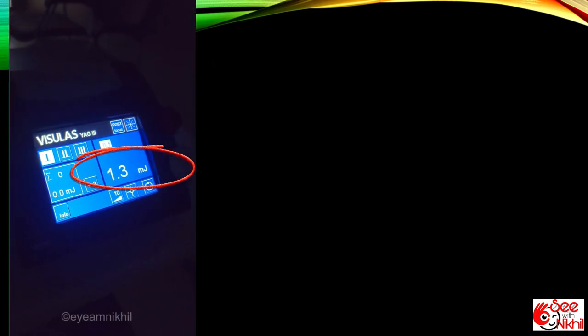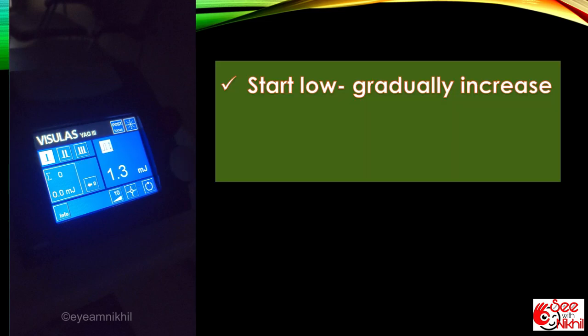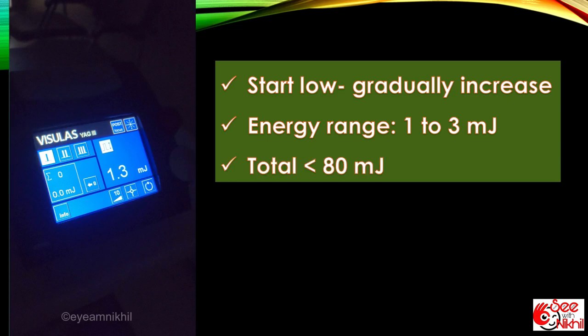Energy is kept at around 1 millijoule. Start with low energy and gradually increase if necessary. The idea is to use the lowest amount of energy required to create an opening. Usual range is from 1 to 3 millijoule depending upon thickness of PCO. We try to keep the total energy applied to less than 80 millijoule.